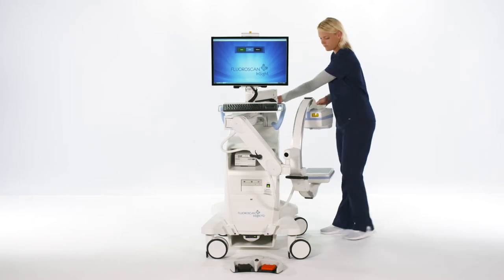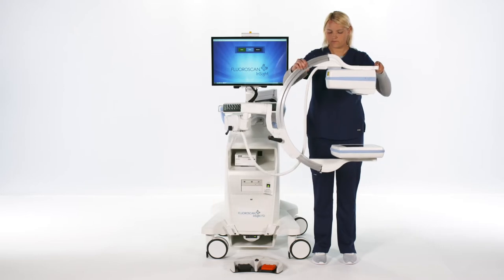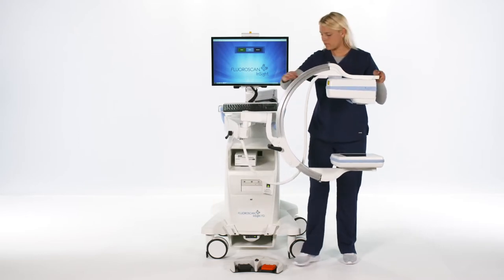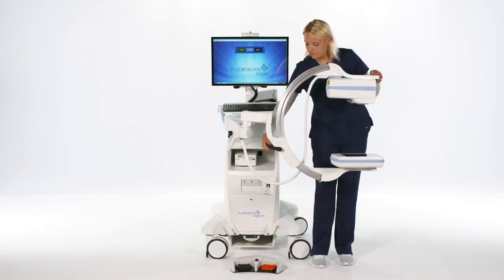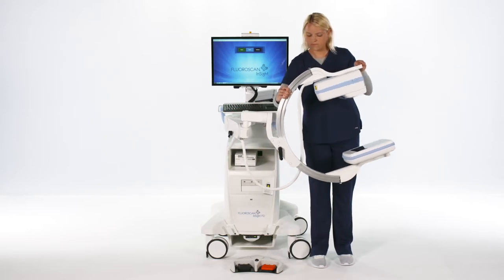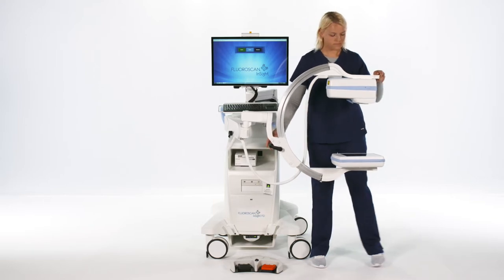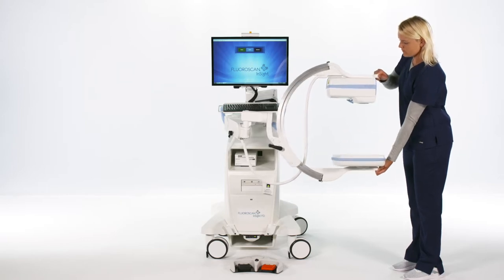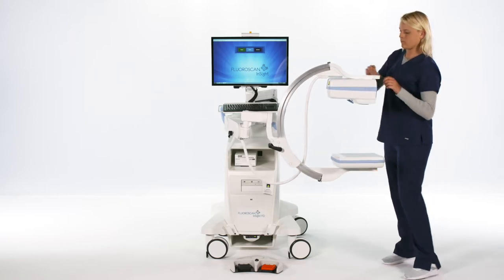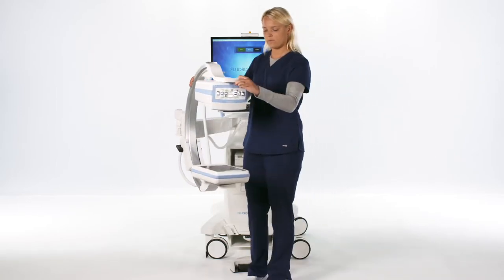The C-Arm can be removed from the white clamp. It has two locks: one for up and down motion and the other for orbital motion. The C-Arm can also rotate horizontally without a lock. Once the desired position is reached, the C-Arm can be locked in place.